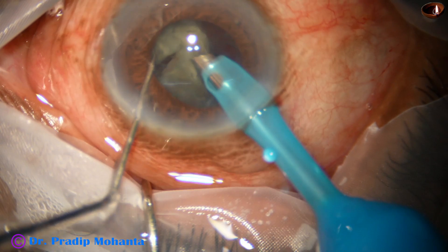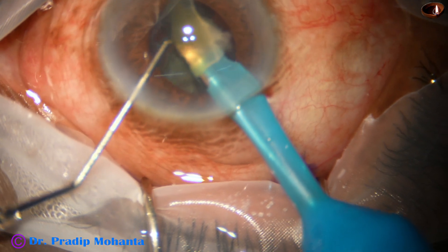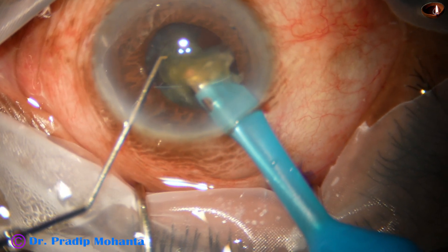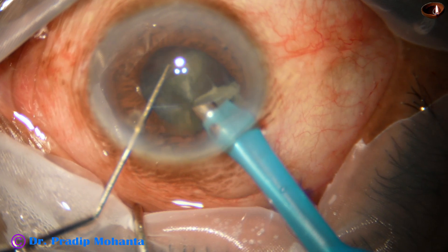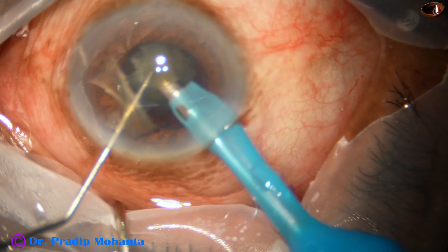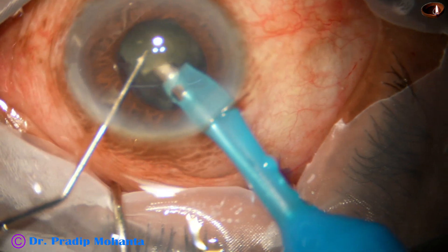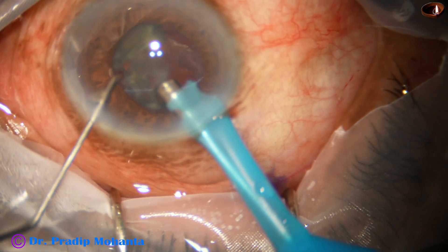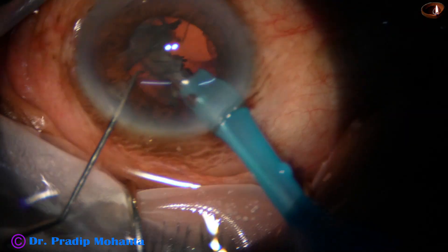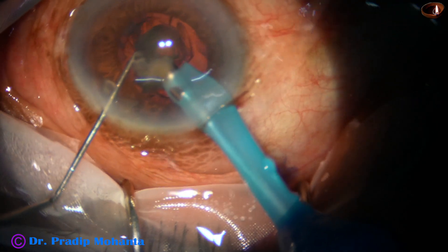This is another piece getting emulsified and this is the third nuclear piece emulsified. The pupil did not constrict to that extent so that I needed a pupil expansion ring, so I continued. The nucleus is grade 3 or grade 3 plus nuclear sclerosis, so it's not very hard. But if the nucleus is grade 4 or grade 5 and the zonules are weak, it is always safer to use a pupil expansion ring or iris hooks.